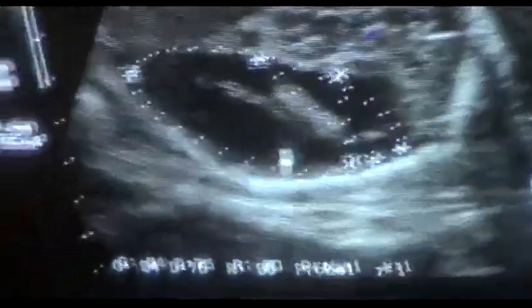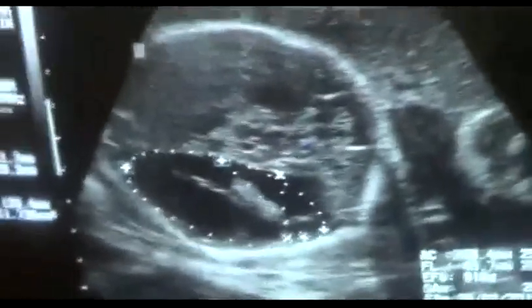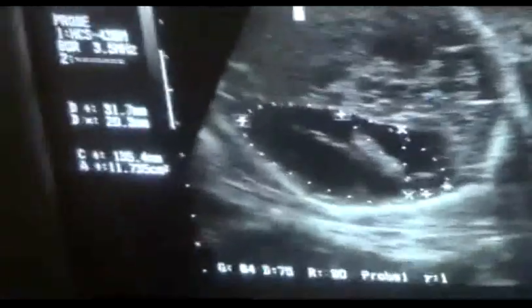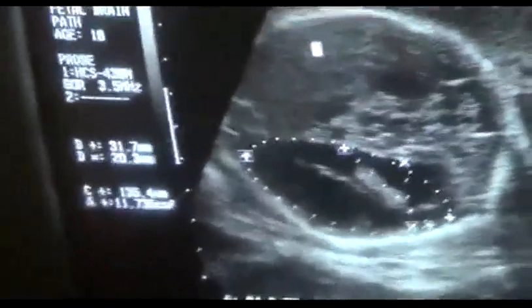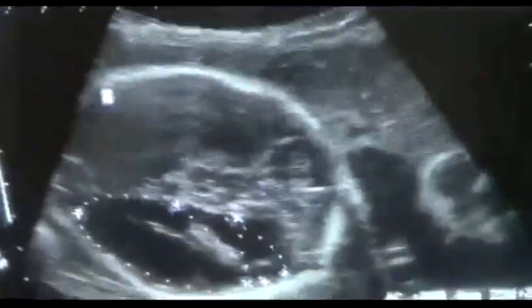So in this case, the brain mantle is not seen. Now this area is close to the transducer, and there are a lot of reverberation artifacts in this region, which is the reason why this area is appearing brighter and white compared to this region.